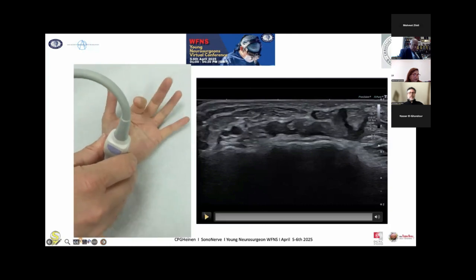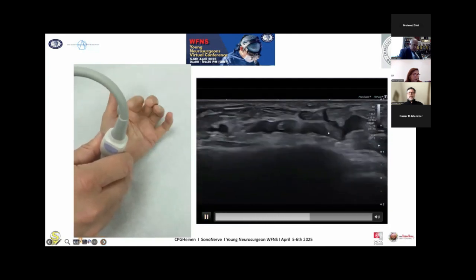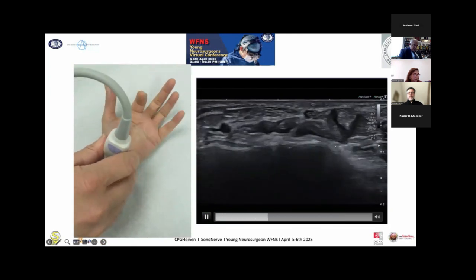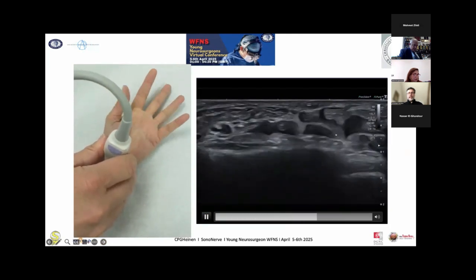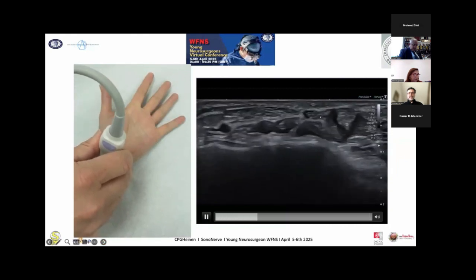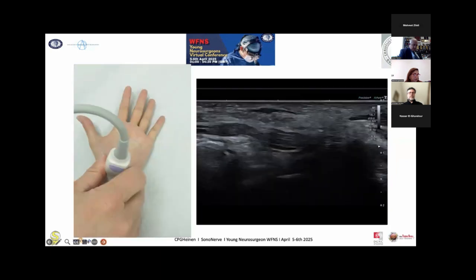This is just a video showing you the nerve. And as the hand starts to move, you see how the tendons are, first, more hyperechogenic, and second, they move, and the nerve just dances around. This is the nerve. So this is very easy to assess.